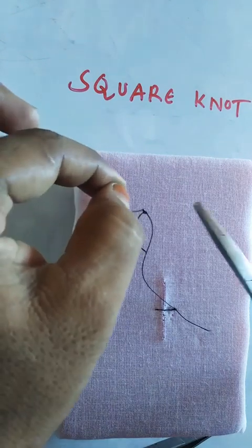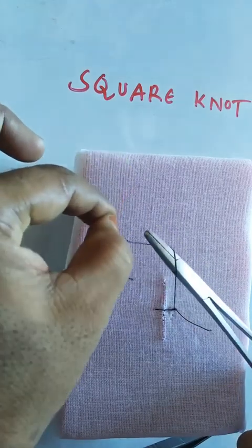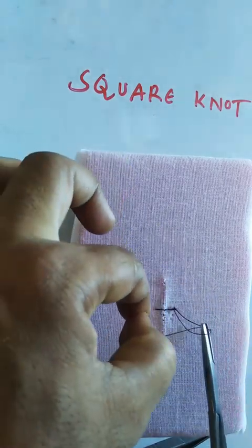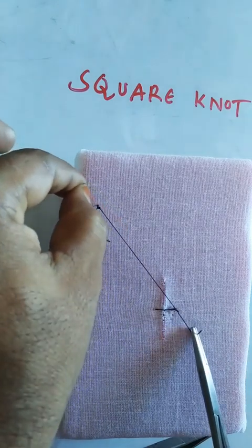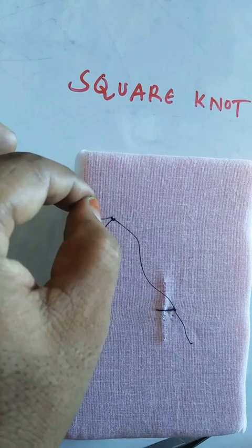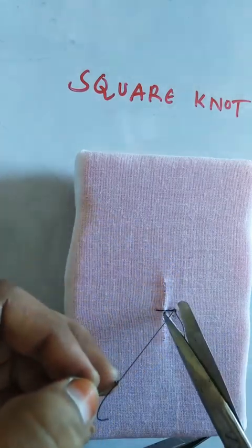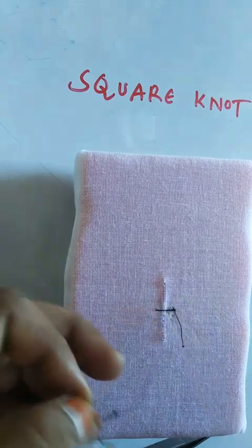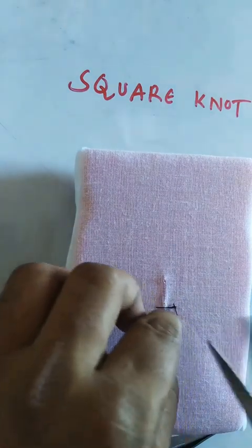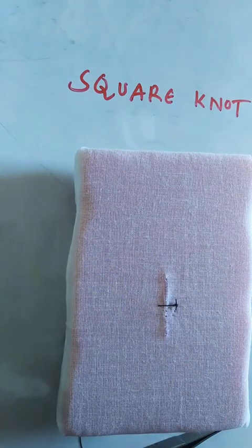And the third tie should be made again in clockwise direction like this. So this is all about the square knot, and after that you can cut the suture ends. This is about your square knot.